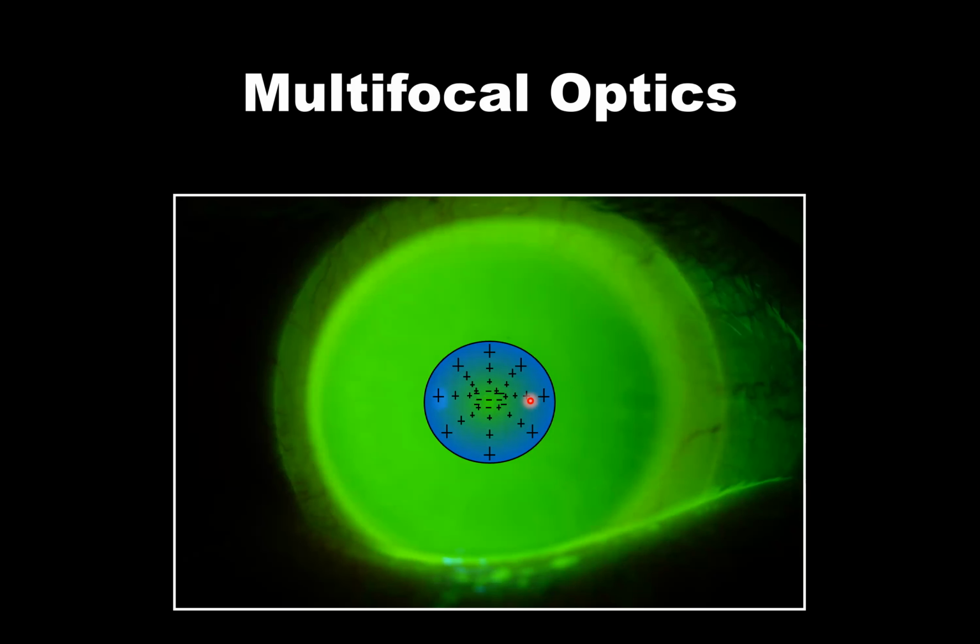In other words, if you have a large pupil and a high power shift, you can order the lens so it creates the appropriate distribution of power for that specific pupil size. If we have a more typical smaller pupil where we need to distribute far more power within a smaller area, that can be ordered from the Spectrum team.